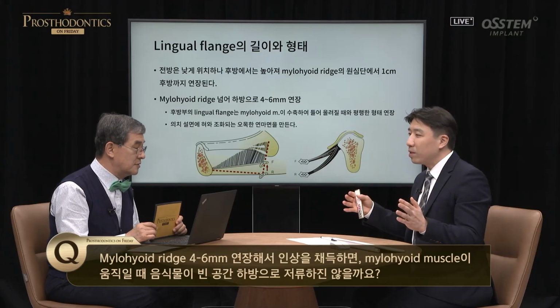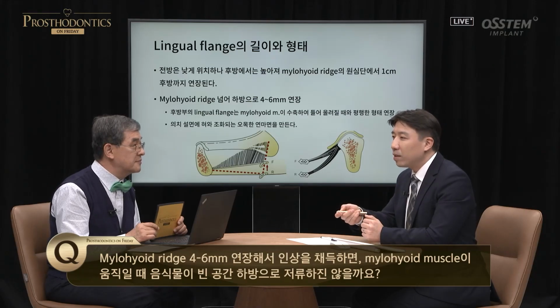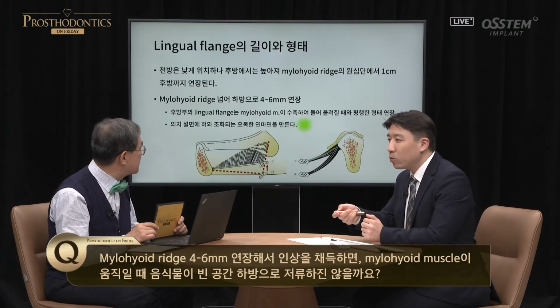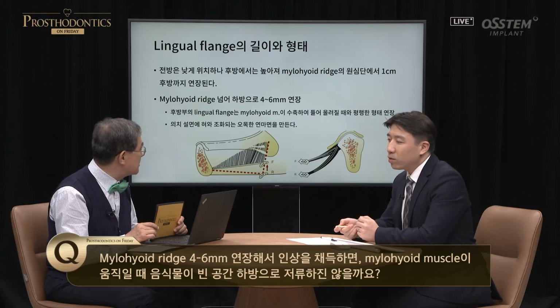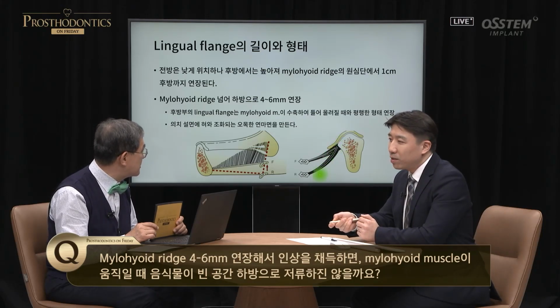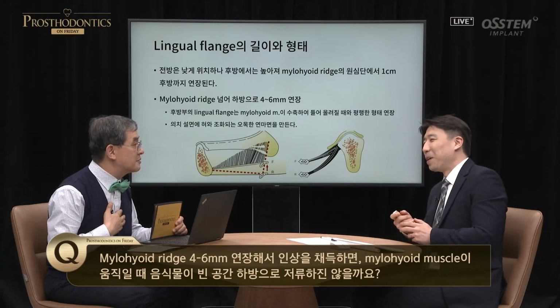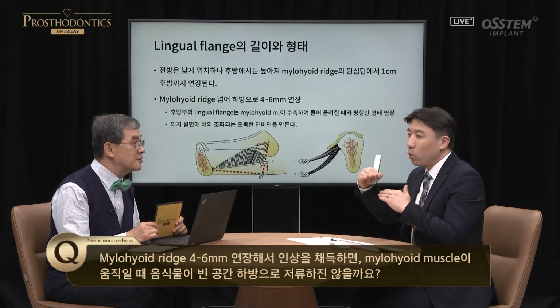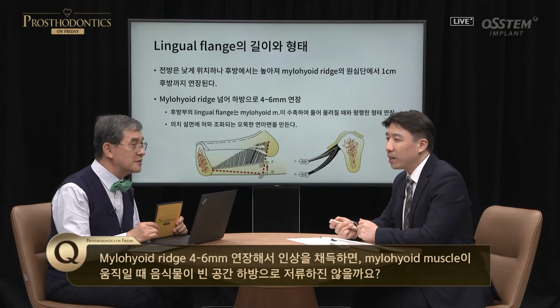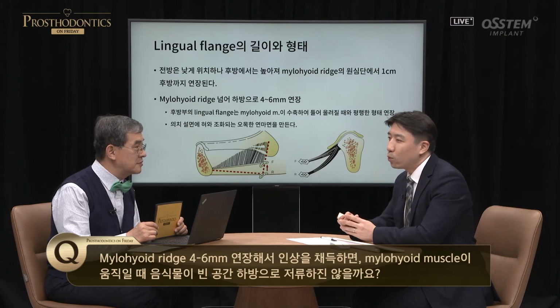As the tongue goes on top of it, the denture is stabilized. The difference with this image is that there's a tongue in an actual patient. Yes, the tongue can go down. I don't think the tongue will go in, but yes. When it goes down, there's a slight space, but it's not significant space as shown here.